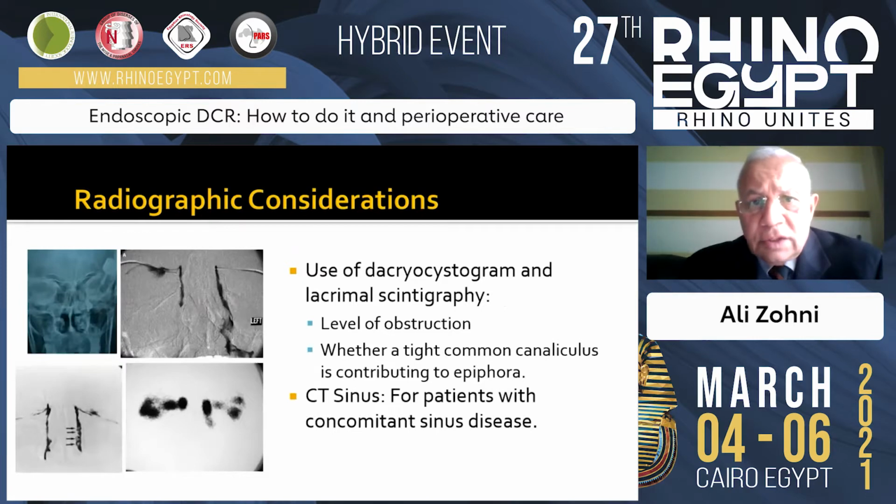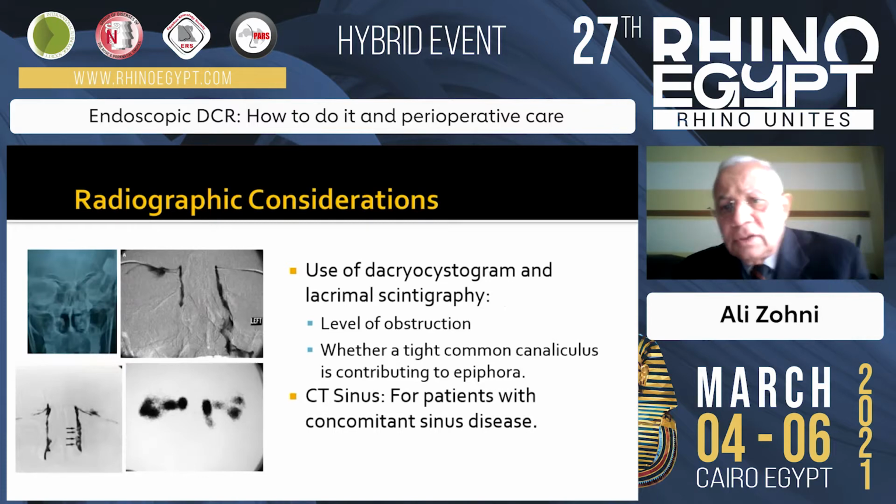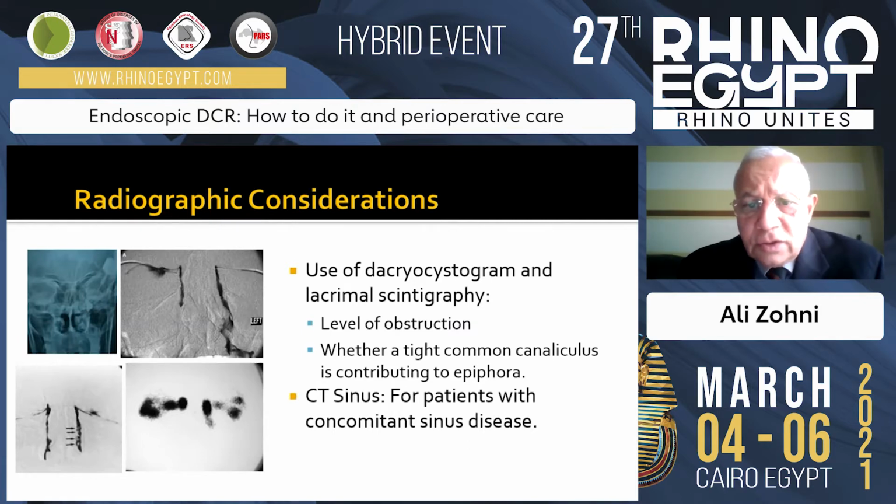Sophisticated radiologic investigation like the dacryocystogram or lacrimal scintigraphy is helpful to detect the level of obstruction and to detect whether a tight common canalicular pathology is contributing to epiphora, which needs special attention. CT sinus is also helpful to detect any concomitant sinus disease.